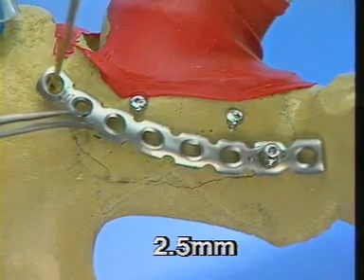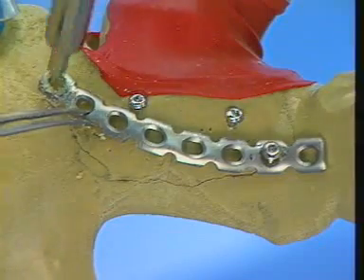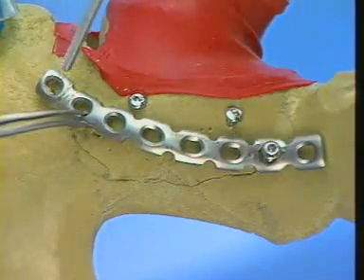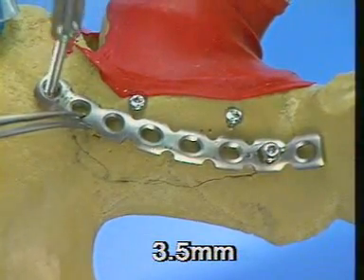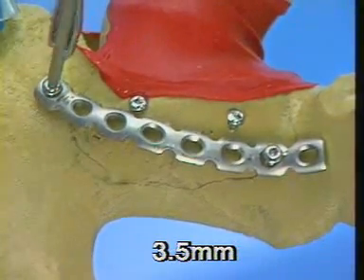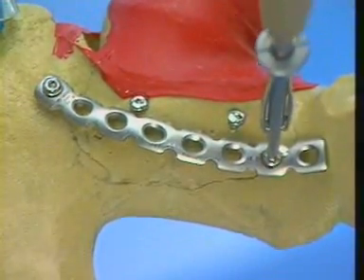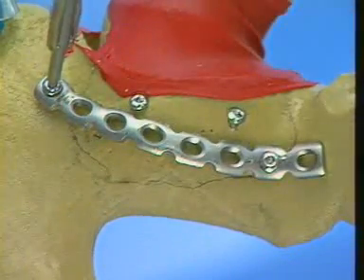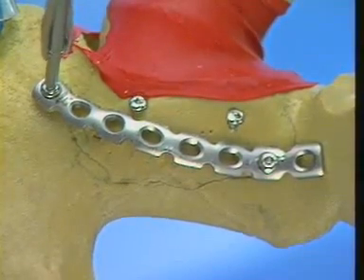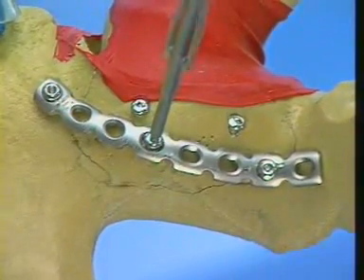A 2.5 millimeter drill hole is drilled through the upper screw hole at the upper extremity of the hole in order to create a compression effect. Measure the depth and insert the screw. Tighten the screws at the two ends of the plate alternately to complete the bending of the plate and tension it over the posterior wall fragments. Always take care to direct the screws away from the joint.